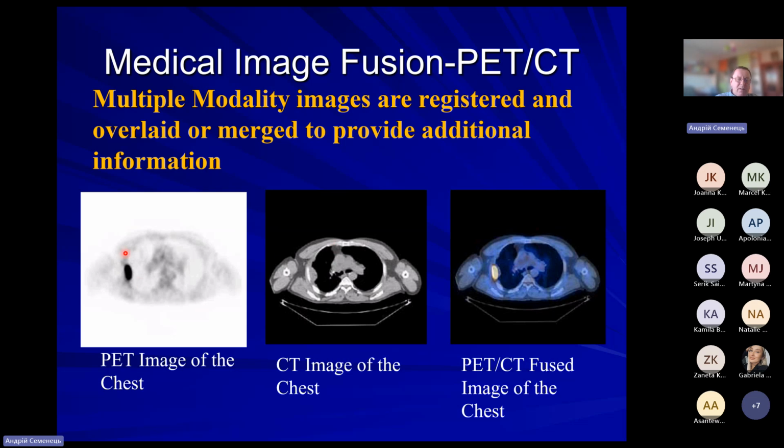We can see active consumption, an active physiological process observed on the PET image, active growth of cells, and so on, which is not so obvious on CT images.